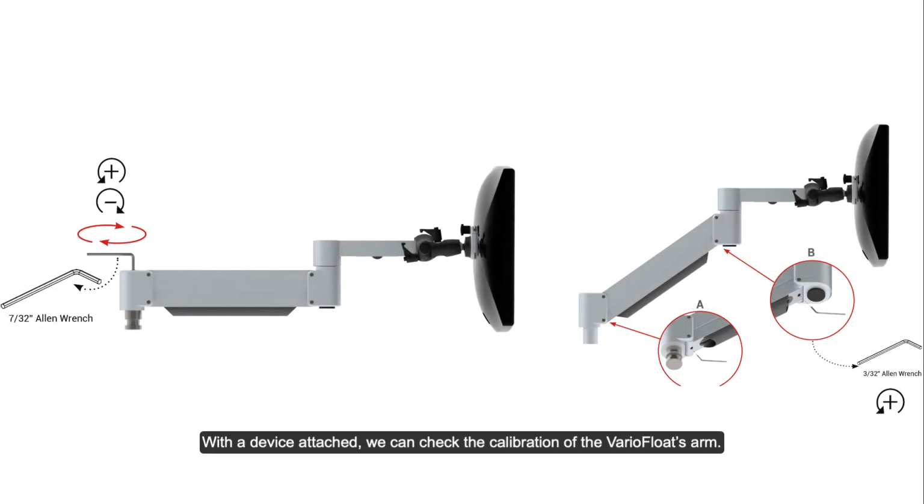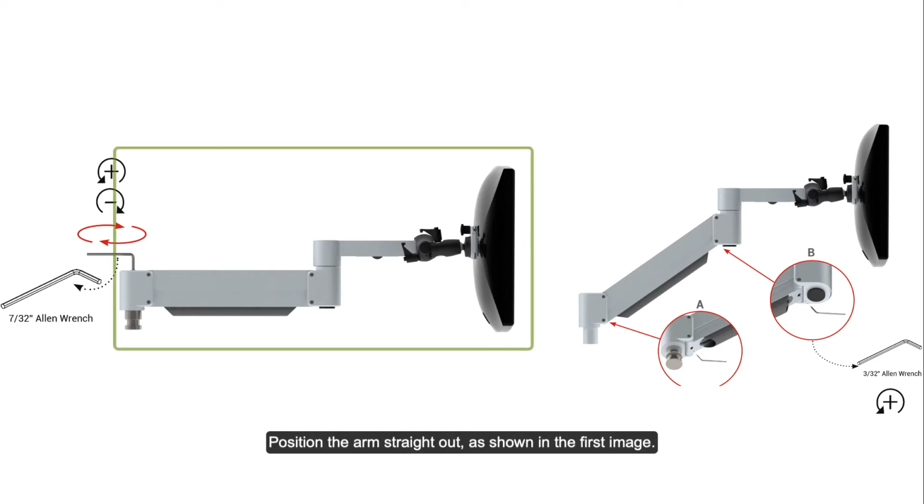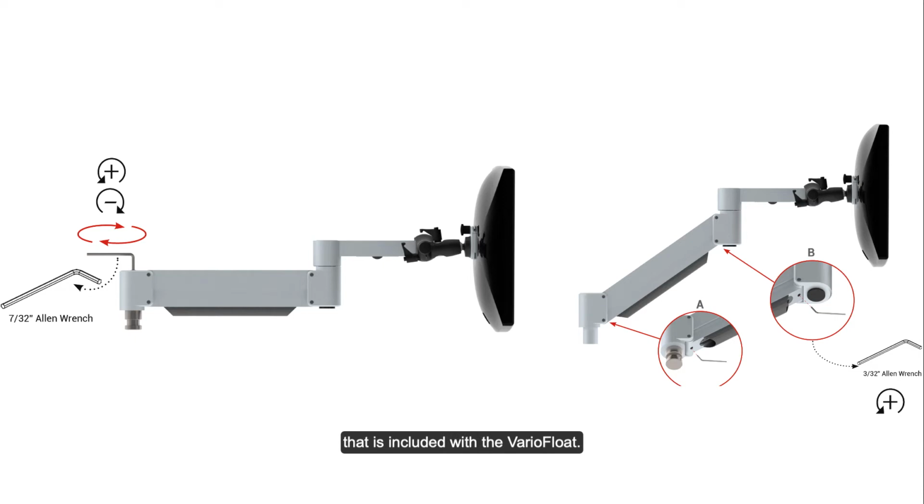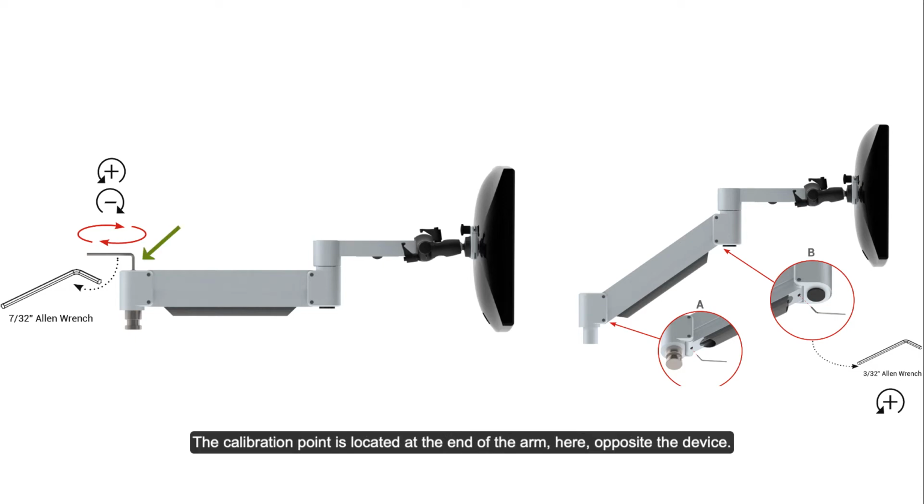With the device attached, we can check the calibration of the VarioFloat's arm. Position the arm straight out, as shown in the first image. If the arm is calibrated correctly, it will remain in place without moving. If the arm drifts up or down, it will need to be adjusted with the larger Allen wrench that is included with the VarioFloat. The calibration point is located at the end of the arm, here, opposite the device.